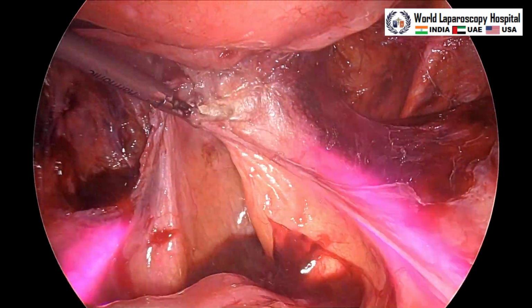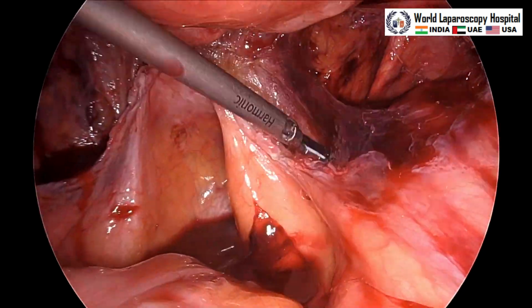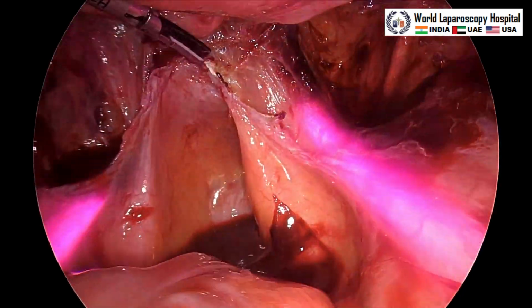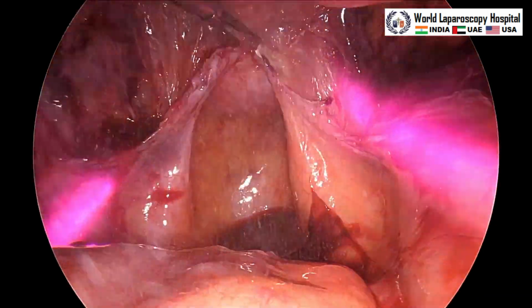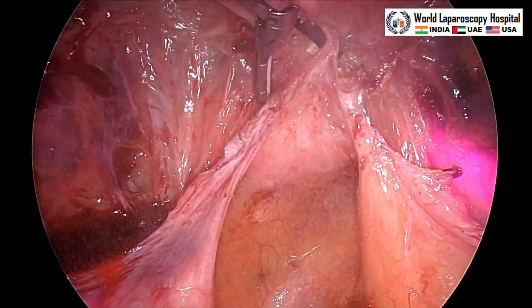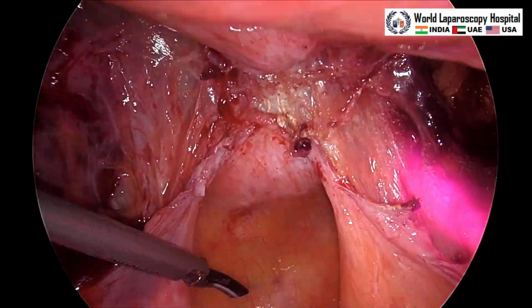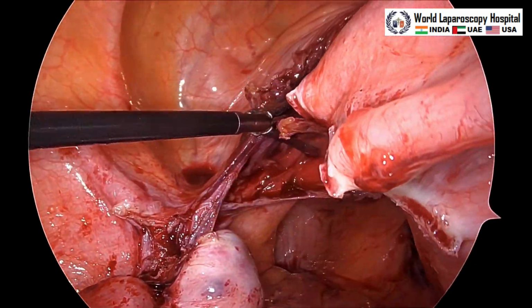So this step will do the further lateralization of the ureter and pushing it down. So this is done. And it's over. This is the uterosacral ligament. Generally we go above the arc of uterosacral ligament.